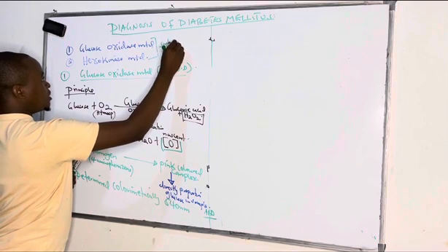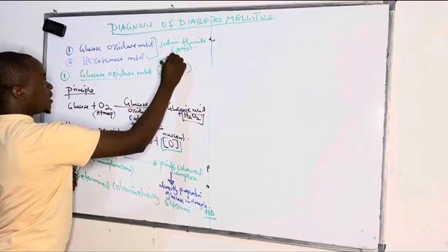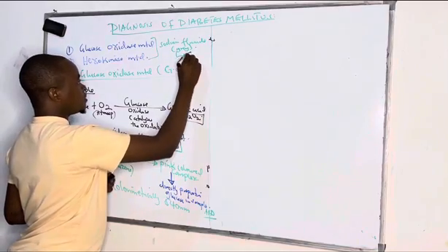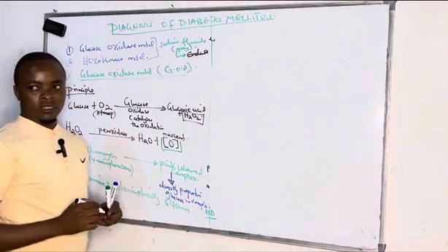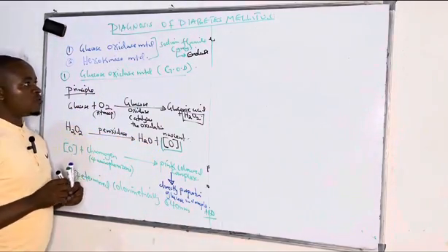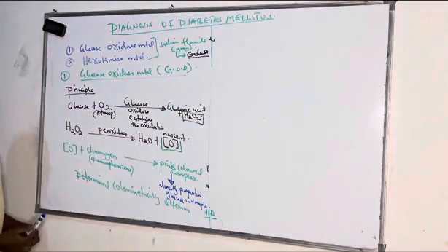So the anticoagulant used is sodium fluoride, whereby the sodium fluoride bottles have a gray top, and they are antiglycolytic, whereby they act by inhibiting the enolase enzyme, which participates in the conversion of 2-phosphoglycerate to form phosphoenolpyruvate. So we collect it in a gray top, and then we can use it to determine glucose.